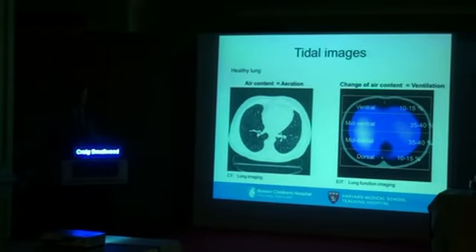I think that's important for a couple of reasons. One, we want to know what a baseline or healthy subject looks like, such that when we have a sick image next to this, we know what to compare it to, and we can interpret it a little more readily. And number two, one of the most interesting areas of the lung is this dorsal region down here. Later today, I'm going to take you through our laboratory experiences, and why that's important. But in the meantime, we all have learned about regional distribution of perfusion.